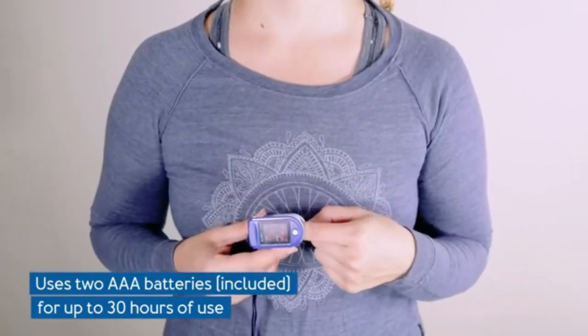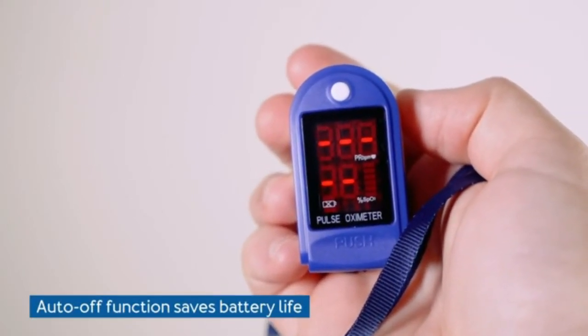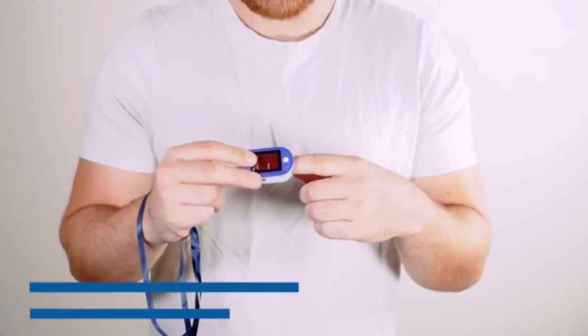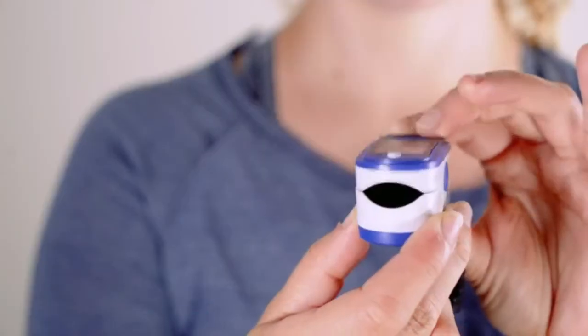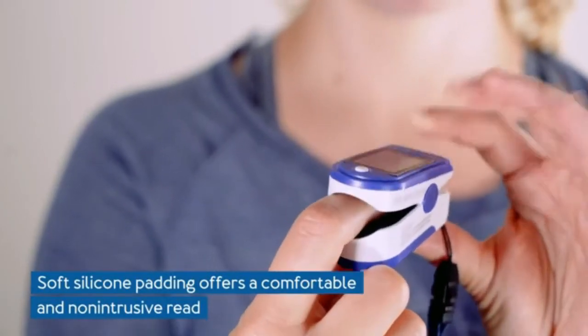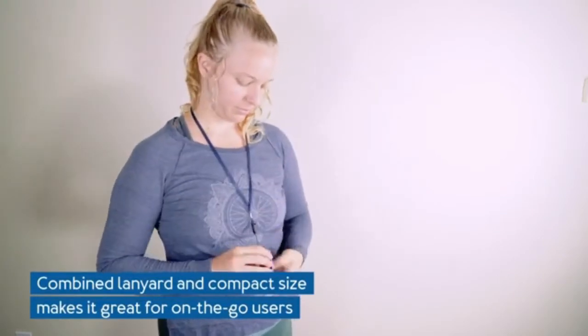Great for physically active people: the finger oximeter is perfect for runners, cyclists, and high performers looking to track their heart rate and SP02 pulse oximeter levels after engaging in sporting activities. Perfect for kids use too — all ages, all finger sizes. Our simple and ergonomic blood oxygen monitor accommodates all finger sizes, so both kids and adults can use it.